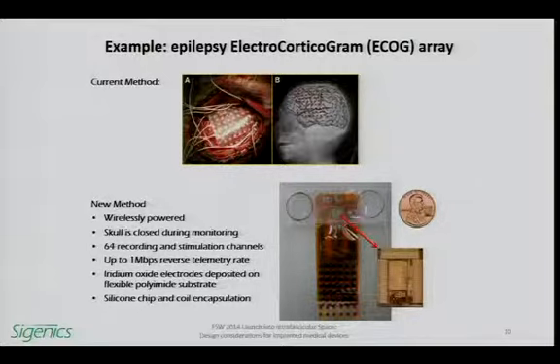So do you learn anything? Does your chip have a capacity to learn what's going on inside, and are you able to reprogram based on the observations? Or contribute to neuroscience research or something like that? No, this is back to limiting the scope of machine activity in the implanted device. The implanted electronics are very simple. Their function is stripped down to the minimum possible set. In this case, that set is to measure and report electrical activity and to produce an electrical stimulation. It does nothing else besides that.